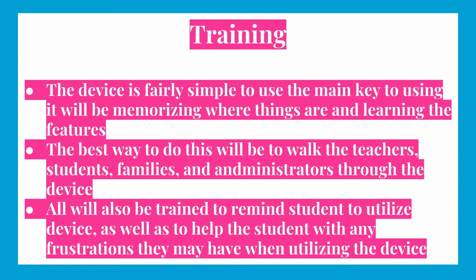I think the best way to actually do the training is to just walk the students and families and teachers and administrators through the device, show them where everything is, and just kind of sit with them until they're comfortable with the device and just be there and answer any questions that they have. I think it would also be important to remind the student to utilize the device because the student might not be used to using a device to communicate, so it'd be important to remind them. And also, I can understand that maybe students would get frustrated with the device, not knowing where things are. So I think it would be important to give the student enough training so that they don't get frustrated.